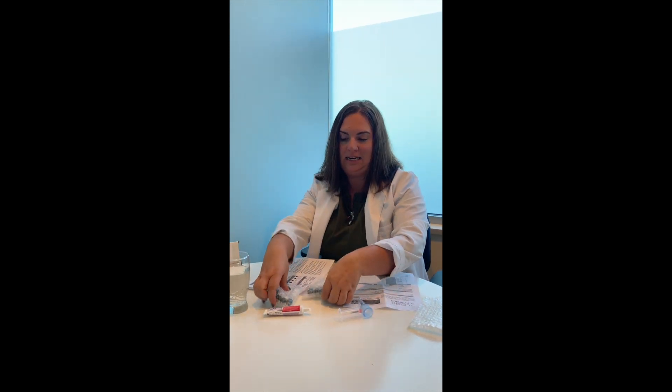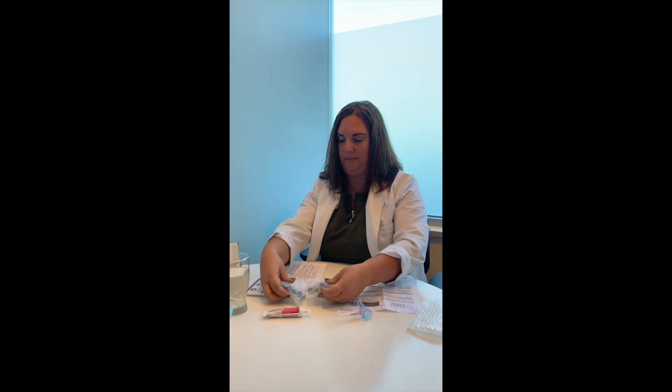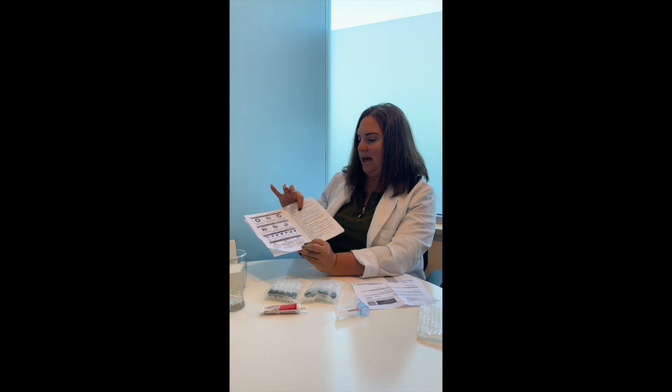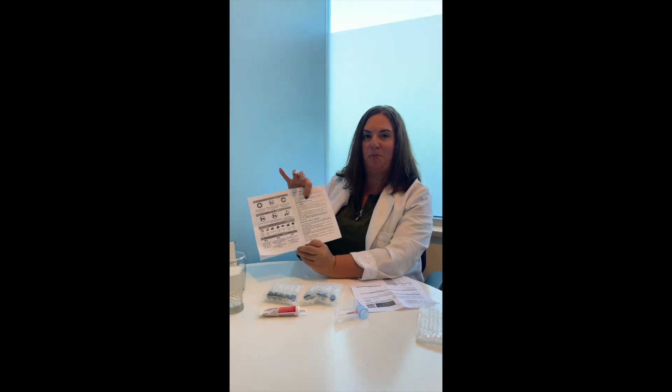So this is what you're going to find within the box. You're going to have a mouthpiece, 10 testing tubes that will be wrapped in bubble wrap. You'll have your intake form. You'll have your instructions on what you need to be avoiding before the test, and helpful hints.